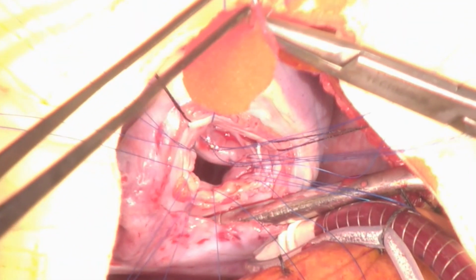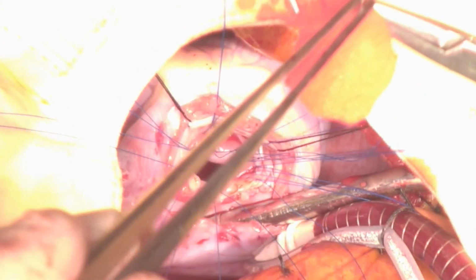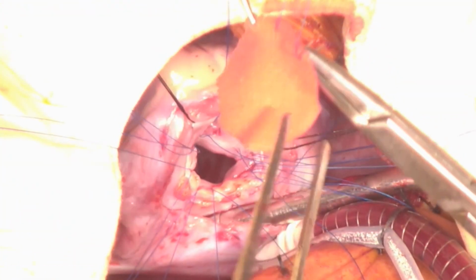Then the sutures placed earlier around the rim of the defect are taken up in turn and passed around the margin of the patch.